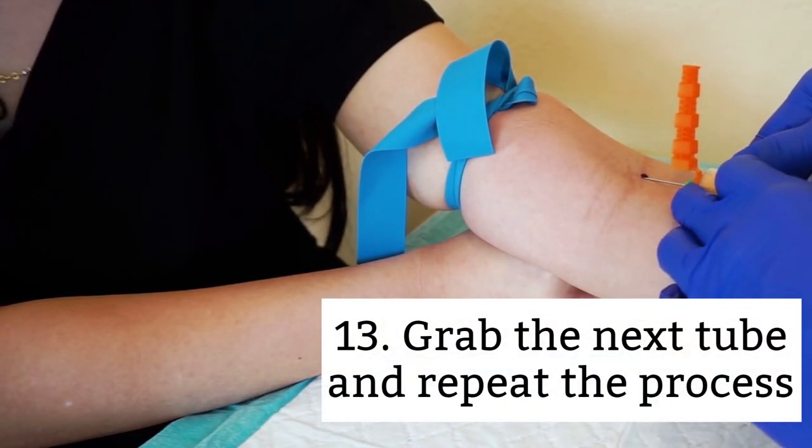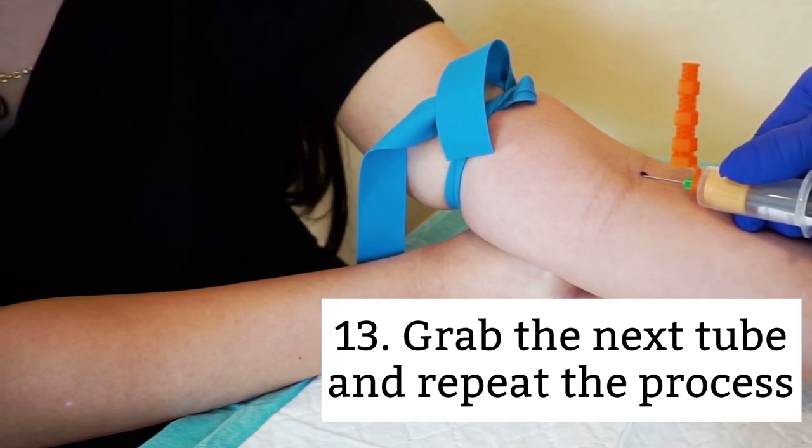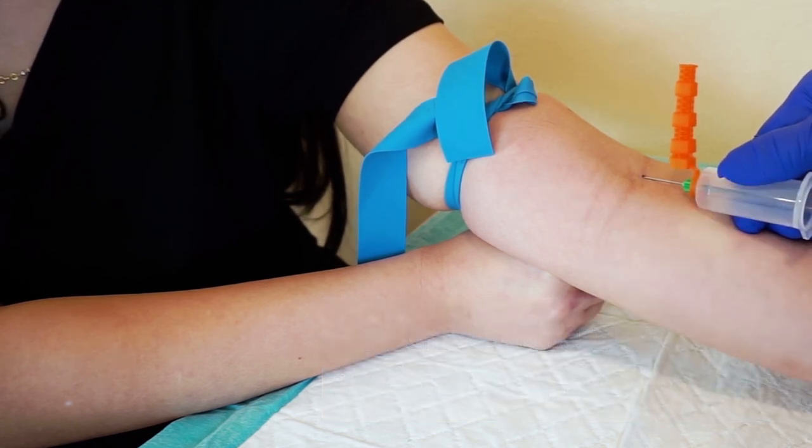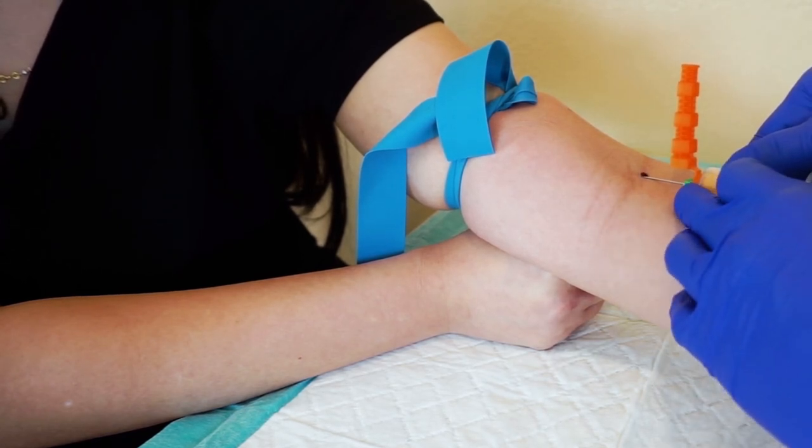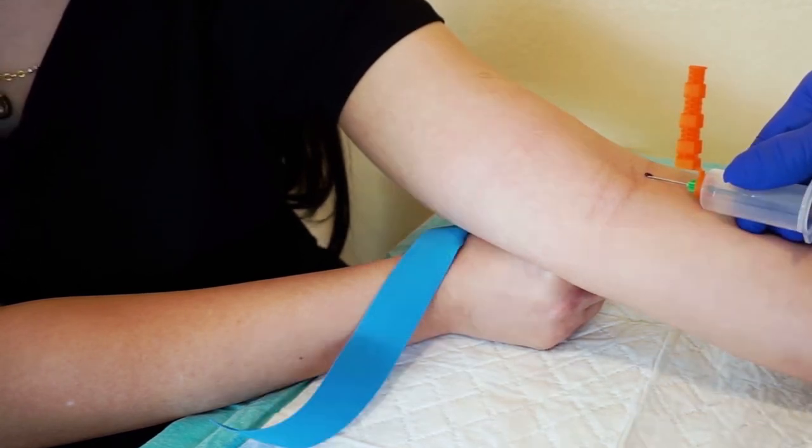Thirteenth, grab the next tube and repeat the process until you have collected all the blood that you need. Note, as you are more comfortable with the process, you can remove the filled tube and insert the next one while you're waiting for the new tube to fill. You can invert the previous tube.